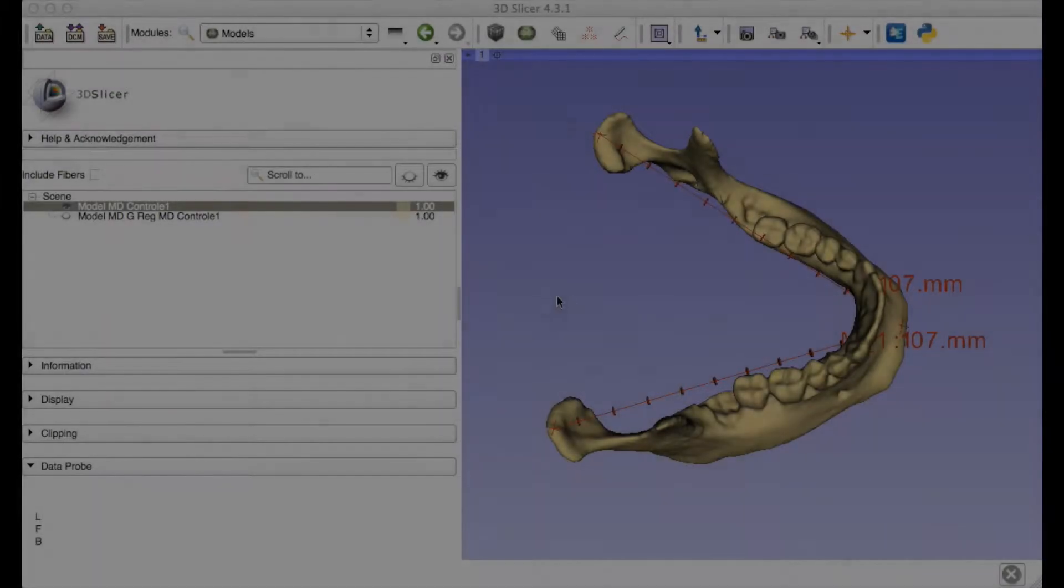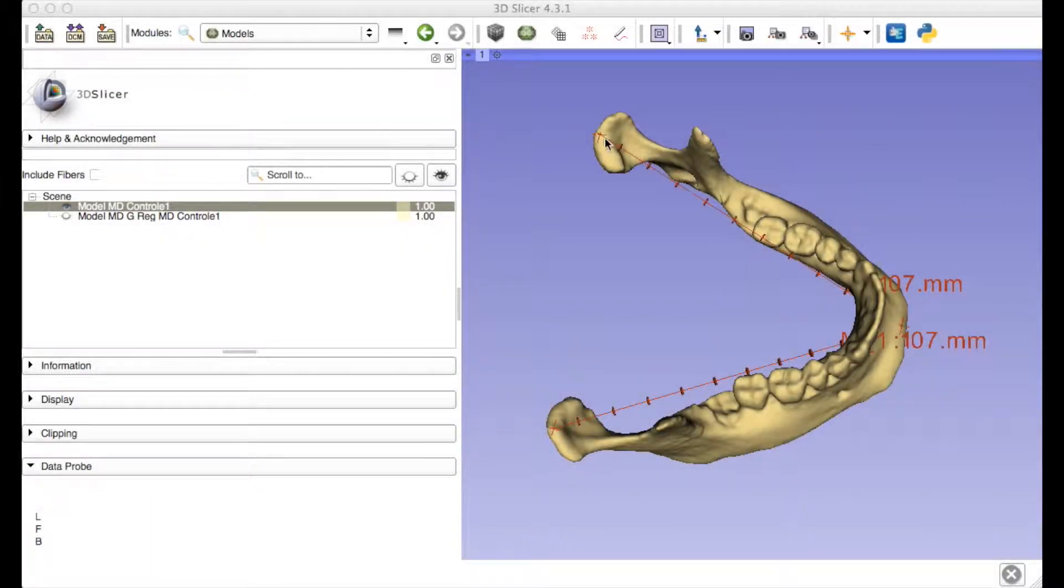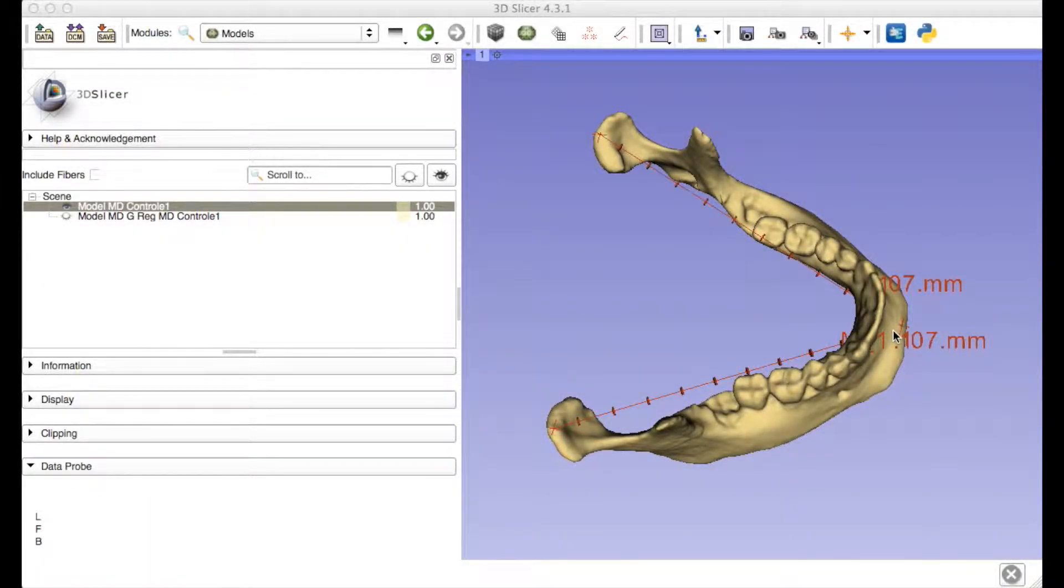Sometimes, 2D measurements on 3D models or x-rays show no difference comparing two sides of one structure. A lack of difference could be accurate or could be due to incorrect placing of landmarks or anatomical variations.